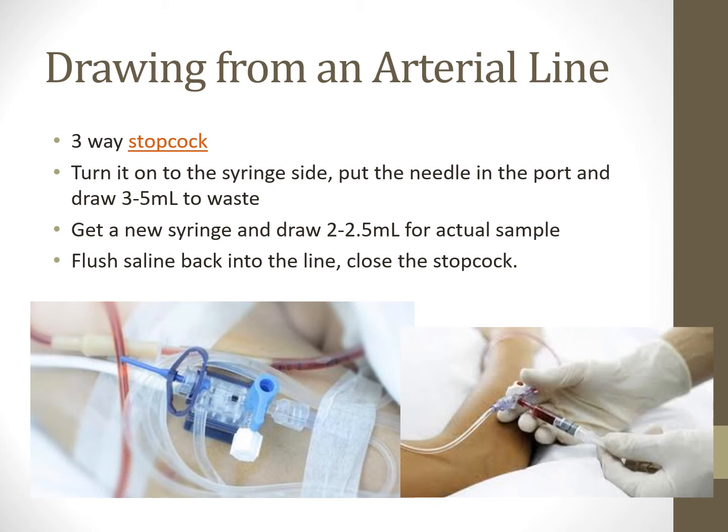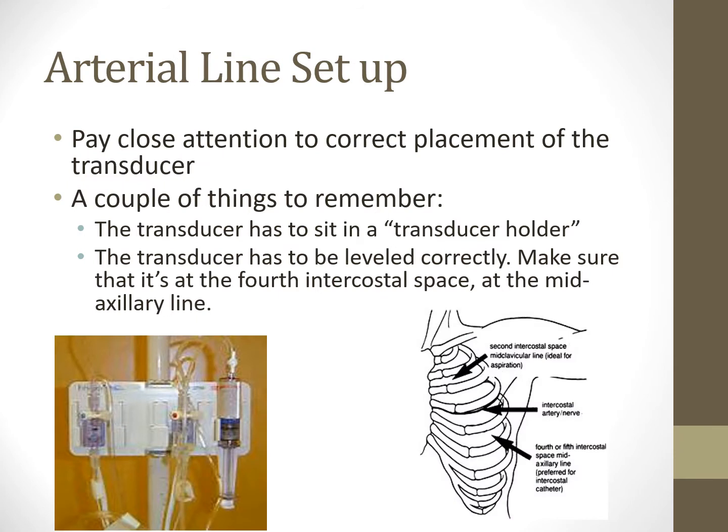Then I actually always said it out loud. I know it's nerdy, but it worked, and I never had an issue with a blood clot in one of my A lines because I always said, hey, clean to site. And I would say it out loud, even if no one else was in the room besides me and the patient. That was my self-check of making sure that I flushed all the blood that was in the line itself back into the patient. So it's a good practice. I highly recommend it because I didn't have any issues with doing that.